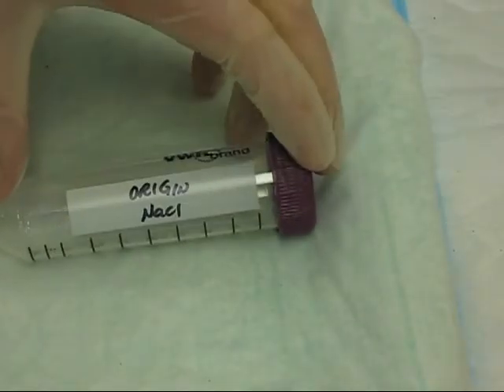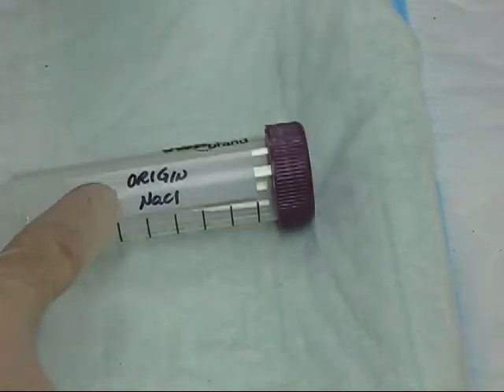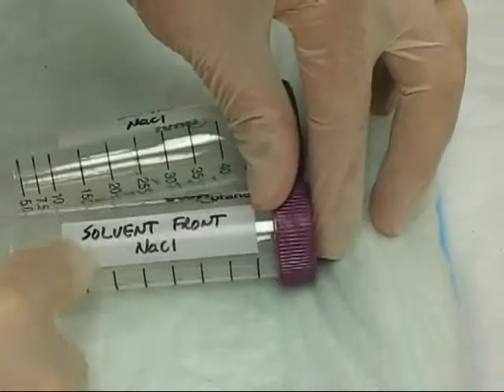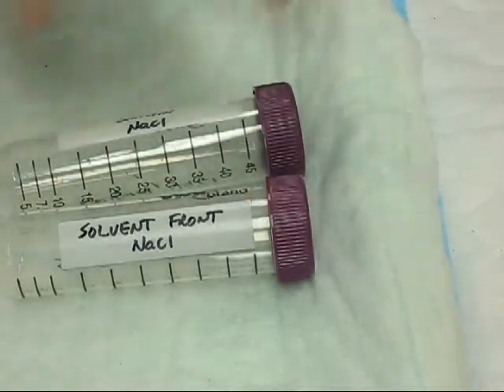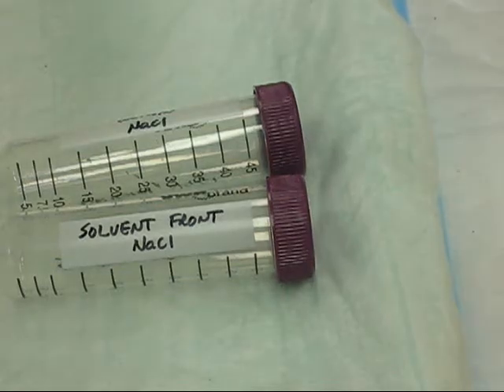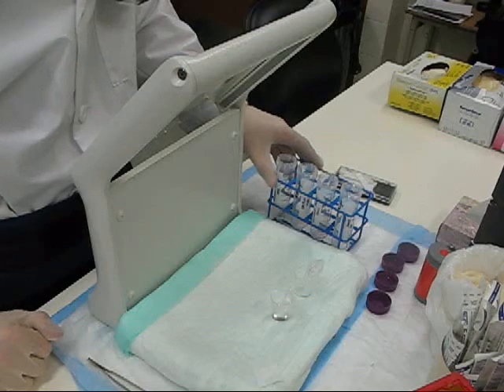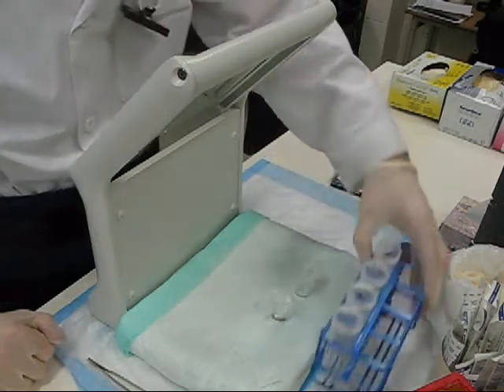When you look at your tubes, you'll notice that they're already labeled Origin NACL and Solvent Front NACL, so please don't write again on the tubes. As the solvent front is moving to the end of the strip, get your containers ready.